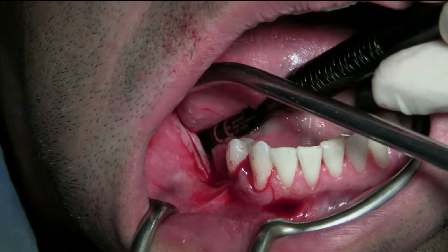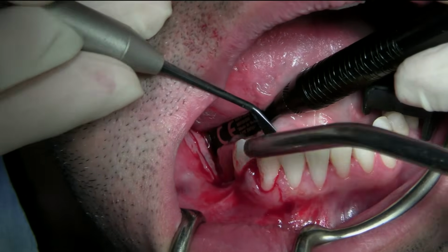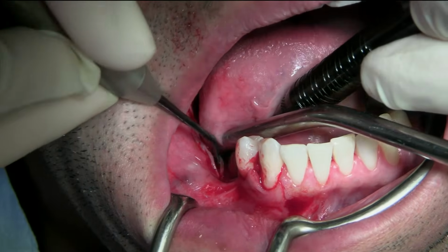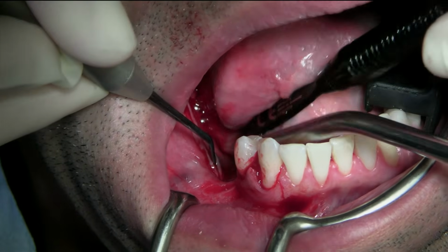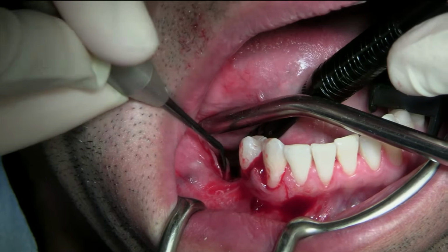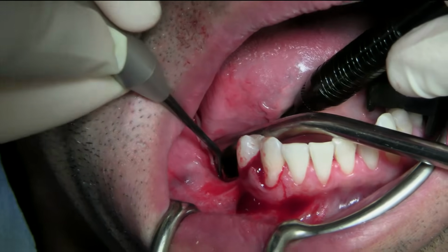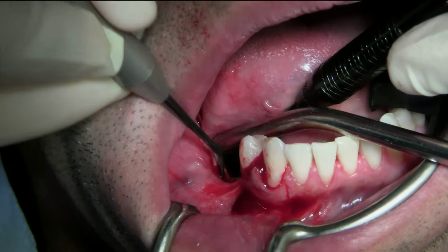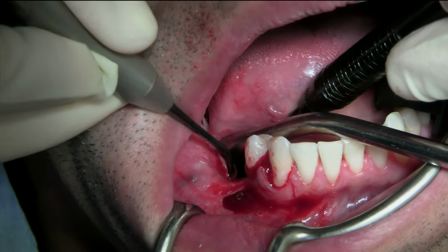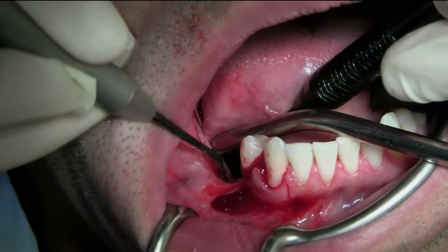Okay, let me have the smaller elevator. I have here a small, almost like a papilla elevator, just to be able to get underneath. I want to be really full thickness on the lingual. Not easy here. The flap on the lingual is really thin. I might also have a little bit of soft tissue ingrowth in the area where the old implant was, so I have to get underneath it.